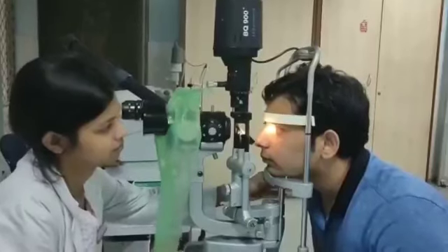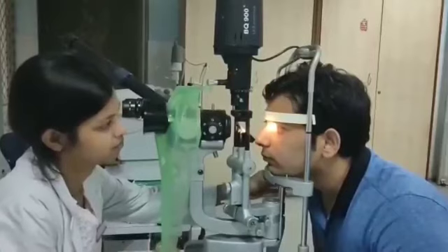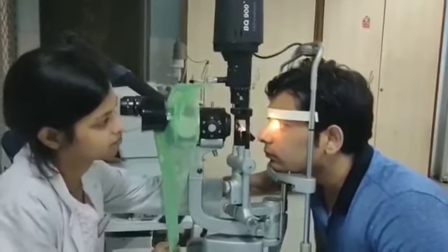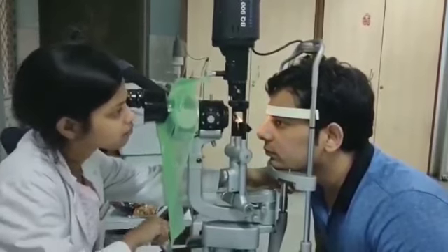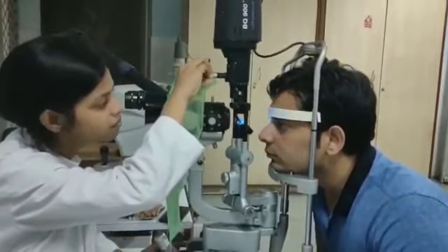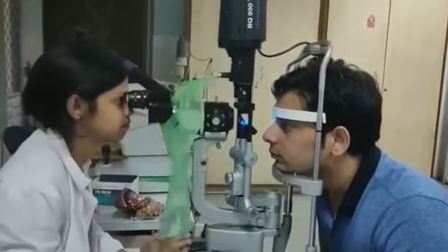Ask the patient to blink several times to ensure that the dye is spread over the eye and mixes well with the tear film. Then ask the patient to sit comfortably on the slit lamp. As we are in the present COVID era, we have installed a protective shield on the slit lamp in our clinic. Examine the patient using the cobalt blue filter. We can also use the blue filter of a direct or indirect ophthalmoscope in case a slit lamp is not available.